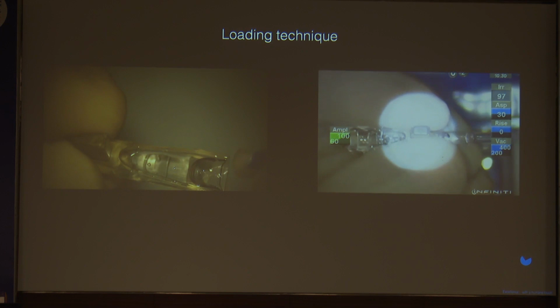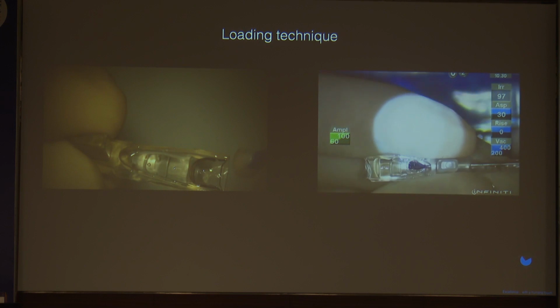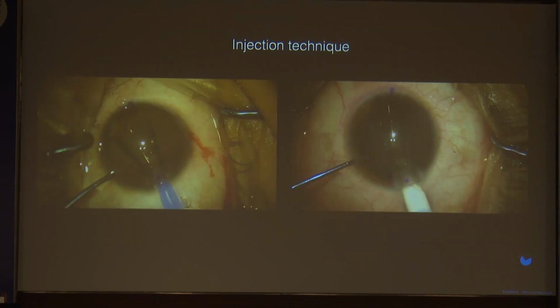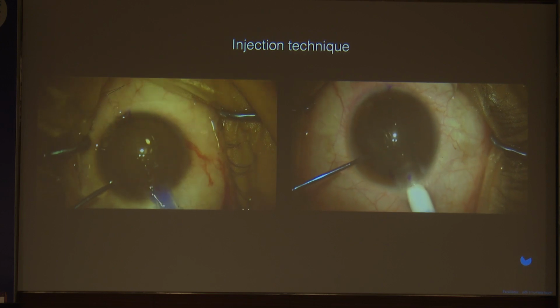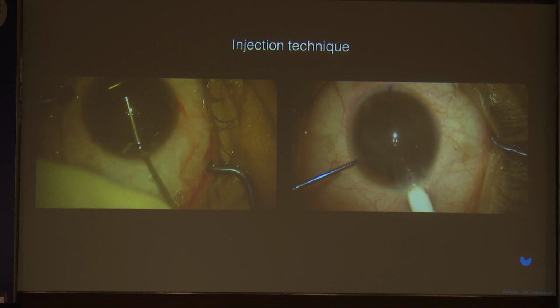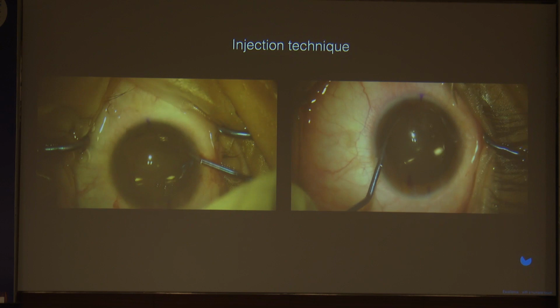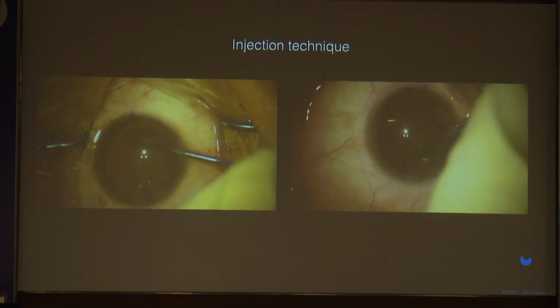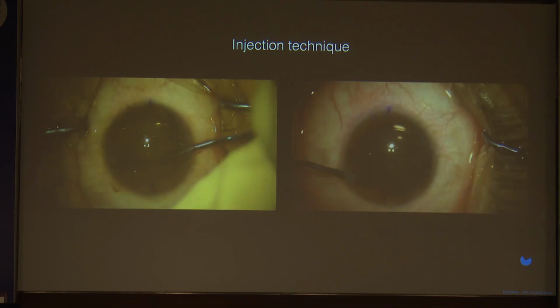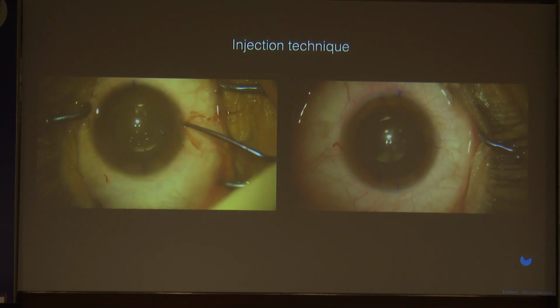Here, after you've placed the IOL, you need to bring it onto the hub of the cartridge with these forceps, and that again does involve a bit of a learning curve. While injecting, always make sure that you're directing the force towards the opposite periphery, not towards the posterior pole. And it should not be a wound assisted delivery. You should be completely in the anterior chamber while you're injecting, and inject very slow. Make sure the orientation is correct, and then while tucking in, engage at the foot plate haptic junction, because that's where the IOL is the most flexible.